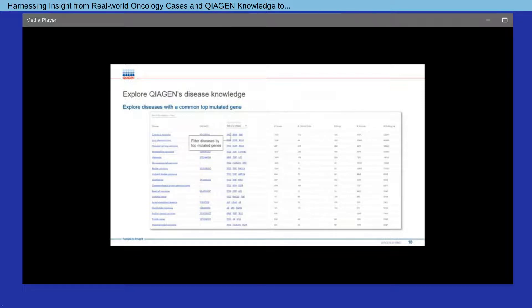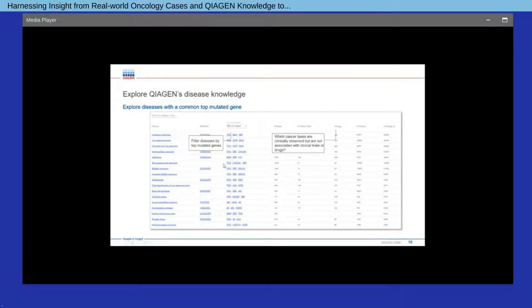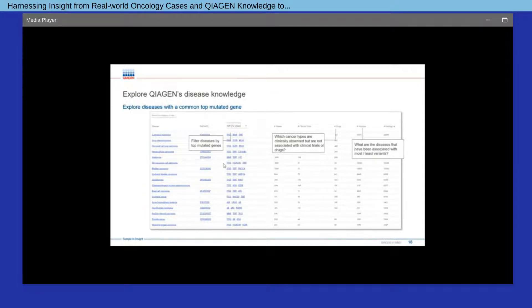The alteration explorer provides the means to search on a codon position to identify how many variants have been observed at that location, how they were classified, and whether they appear in clinical data or were found through proactive literature curation. You can also explore HSMD from a disease perspective — asking which diseases are commonly mutated by a specific gene, which cancer types have been observed clinically without associated trials or drugs, or which diseases have the most or least associated variants.